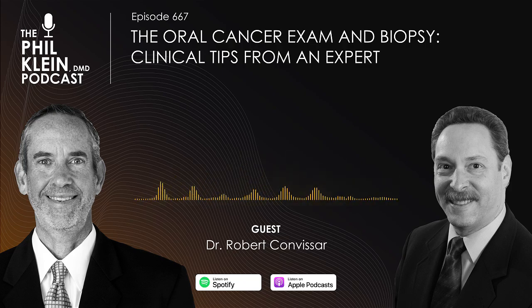So we haven't talked about the actual part where you actually remove the specimen. What do you do with it and how is it handled? Is that typically handled by your staff? That's something that I do. As soon as I have the biopsy removed from the tissue, the biopsy jar is on my bracket table. I just drop it in the biopsy jar, fill out the form, and send it out. And the biopsy jar and all the instructions and all the paperwork you get for free from the biopsy service.